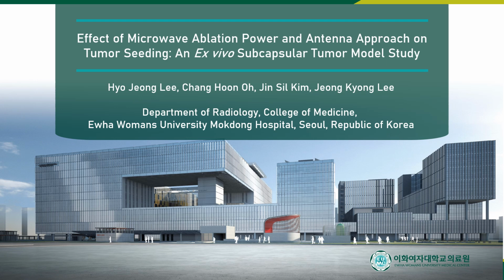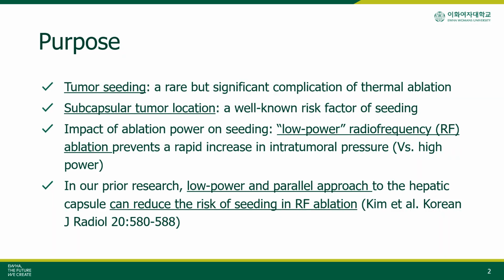The title of this study is Effect of Microwave Ablation Power and Antenna Approach on Tumor Seeding, an ex vivo subcapsular tumor model study. Extrahepatic tumor seeding is a rare but significant complication related to thermal ablation, and the subcapsular tumor location is a well-known risk factor. Low power radiofrequency (RF) ablation has been reported to delay steam popping, thus helping to prevent tumor dissemination compared to the high power protocol.